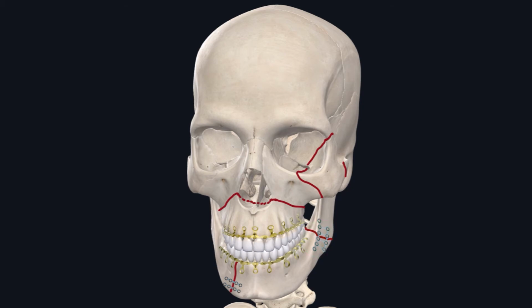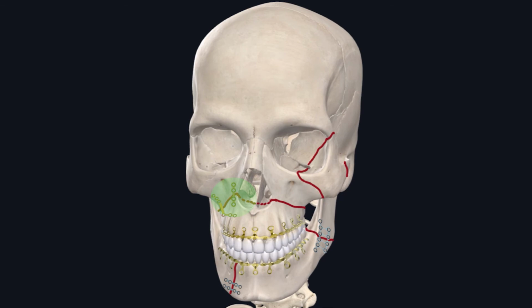Next, we'll work on the right Le Fort 1 fracture. The reason we're going to start with the right side is that if you look at the left side, there's a left ZMC and left Le Fort 1. So there's a high probability that the lateral buttress along the zygomaticomaxillary suture line might be comminuted. So we'll work with the right Le Fort 1 fracture, then move on to the left side at the zygomaticofrontal suture line and begin with the left ZMC fracture repair next.